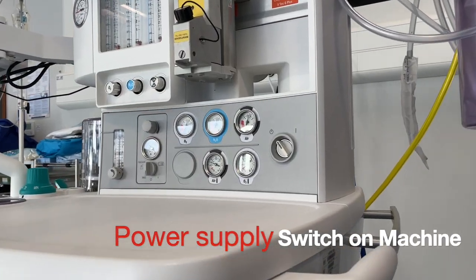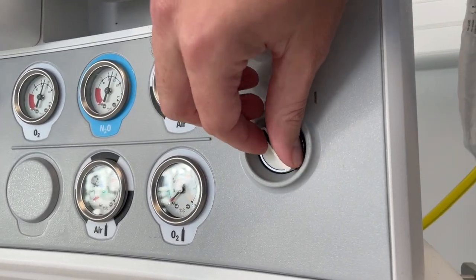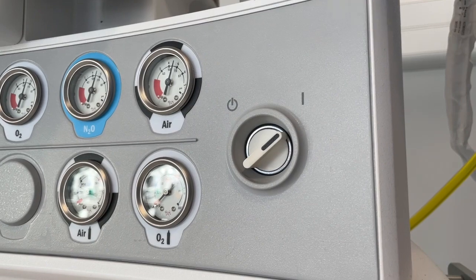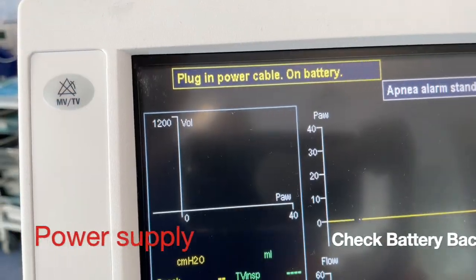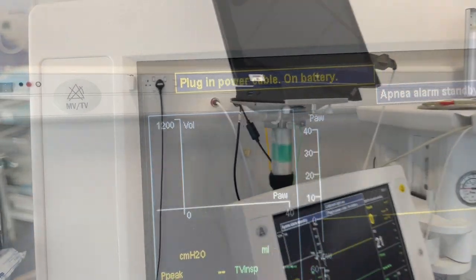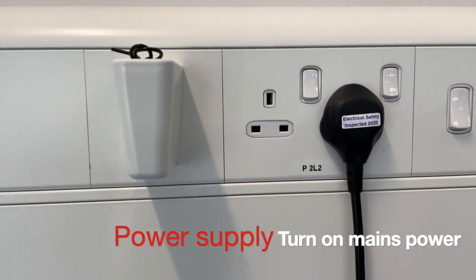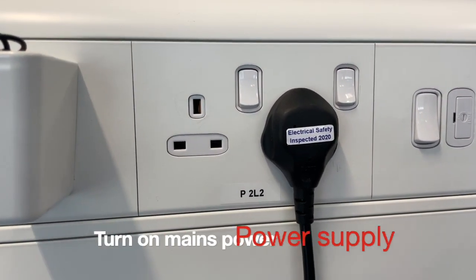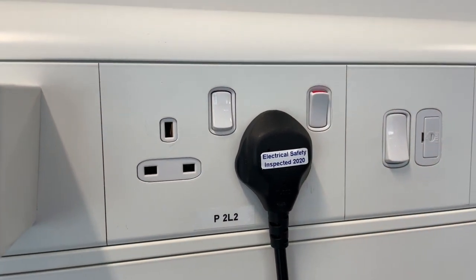The first item on the checklist is the power supply. There can be some variation in the location of the on switch for the machine, but they're usually somewhere near the front. All modern machines should have a battery backup in case of a power failure, and one way to check that this is working is to turn the machine on whilst having the power at the wall supply turned off. But once we've established that the battery is working, we must remember to turn the mains power on.